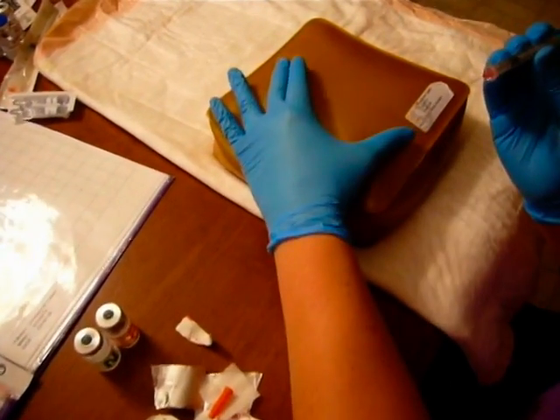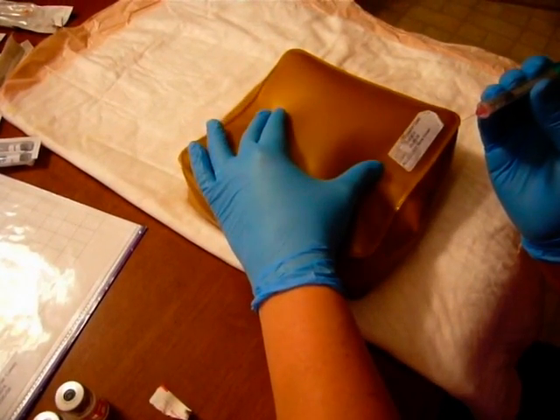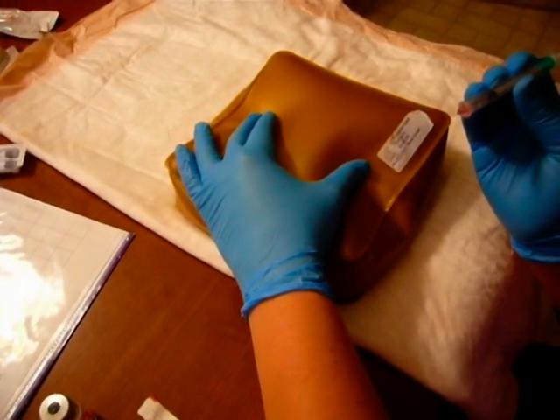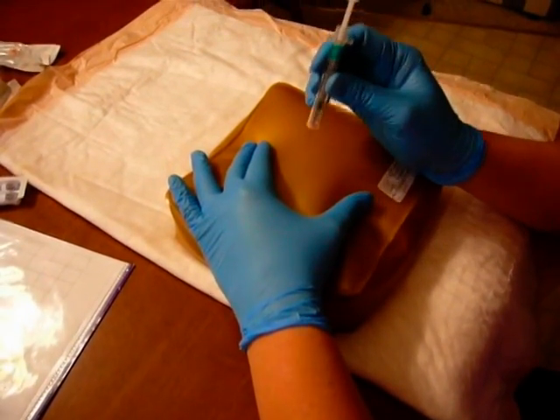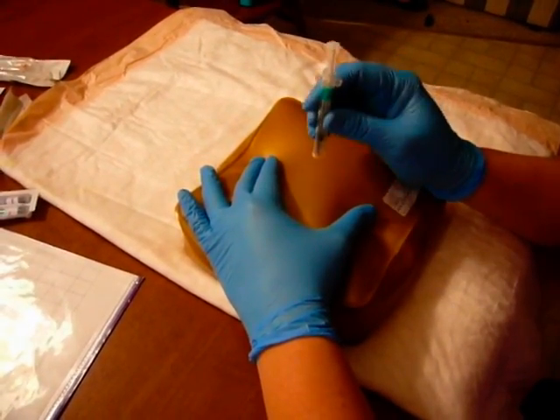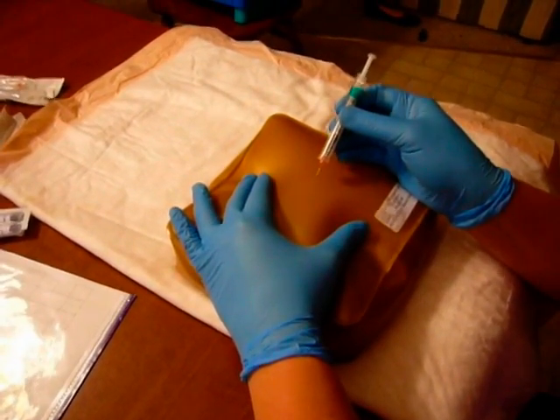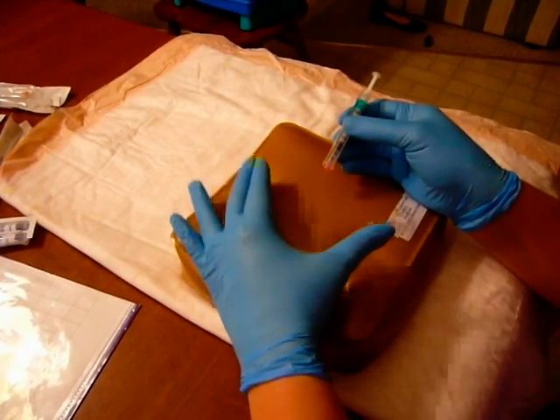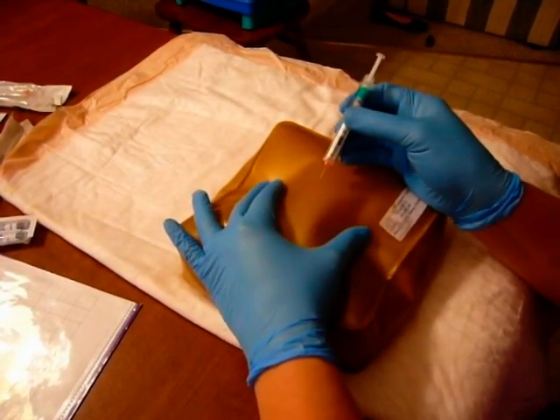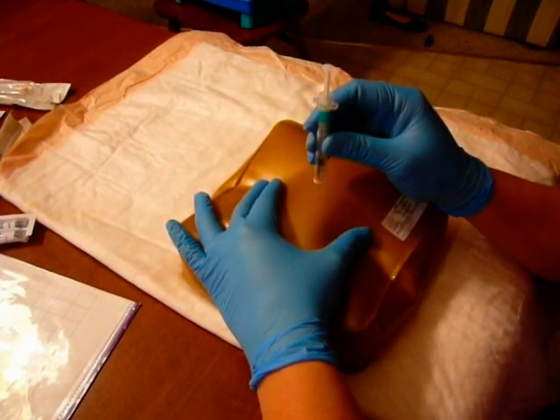You're going to gently tent the skin up because you want to bring the subcutaneous tissue up off the muscle layer underneath. Stabilize your hand, and note that the subcutaneous injection will either go in at 90 or at 45 degrees depending on the patient's subcutaneous fat layer. If you lower the angle from 90, make sure you're always parallel to these two fingers. My patient definitely has enough subcutaneous tissue, so I'm going to go in at 90 degrees.